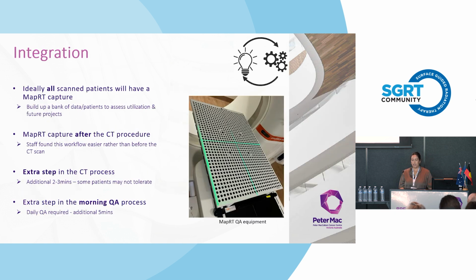In terms of integrating MapRT into our own workflow, we decided to take a MapRT capture of all patients who had a CT scan with us to try and build up a bank of patient data, which we can then use to assess utilisation and also for any future projects.